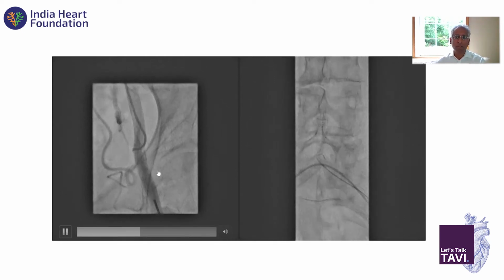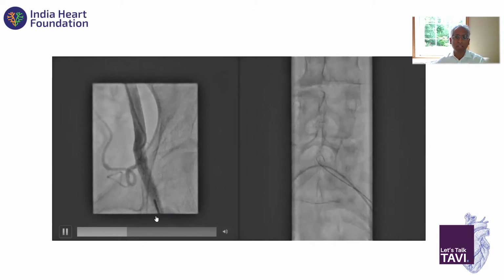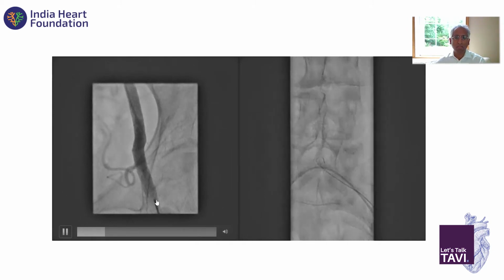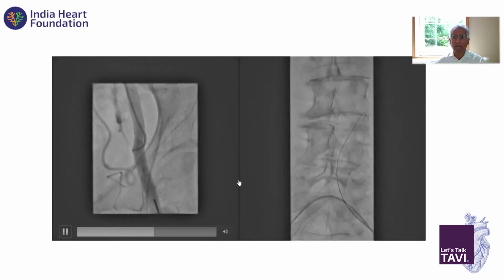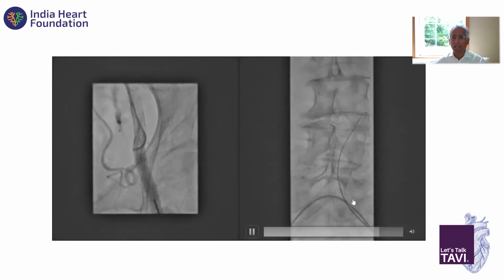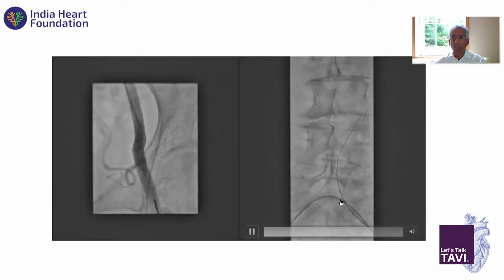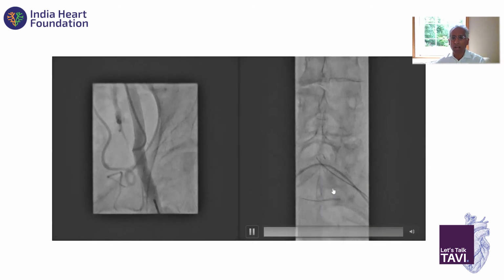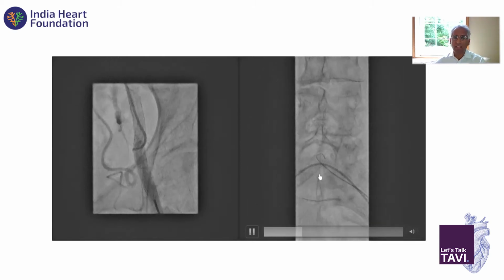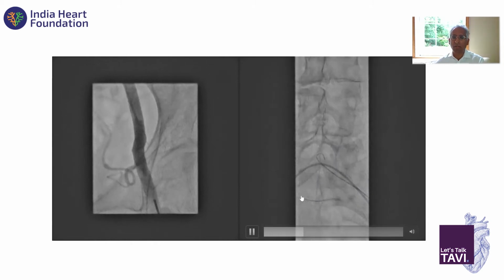I used fluoroscopy guidance here, because the aim is to puncture anteriorly and in the middle of the vessel. And even here, you can see how much, during systole and diastole, the artery just moves left and right, and left and right. That's important to remember. You want to puncture middle and anterior. The other thing to remember is that when you're advancing the wire after the puncture, just look at what the wire itself is doing. You can see the wire naturally wants to push against the right ostia of the iliac, and then there's a little calcific area. So be very careful when you're advancing wires.